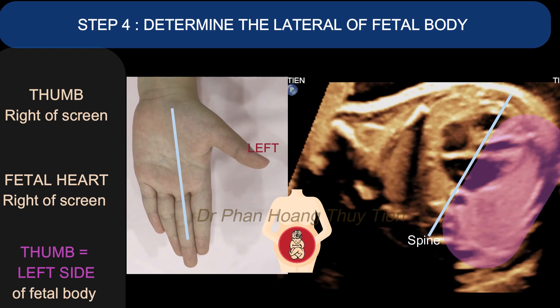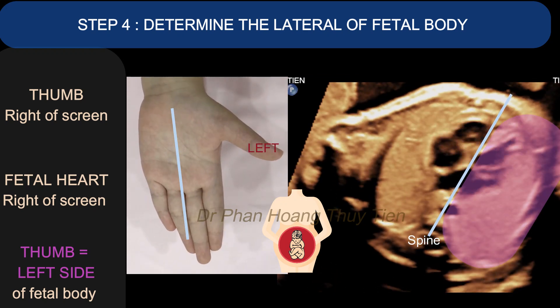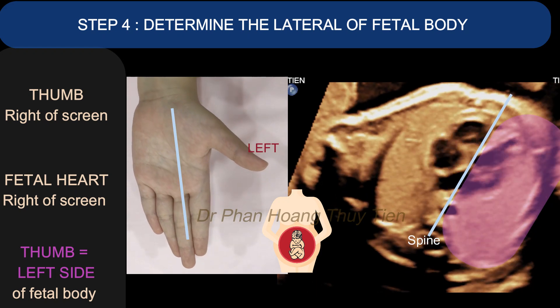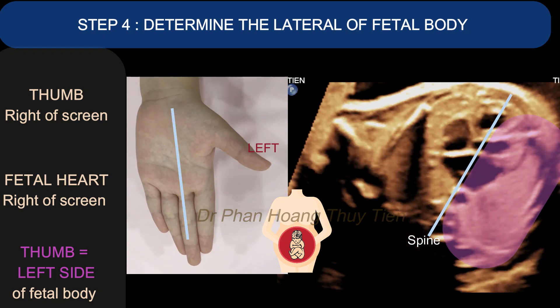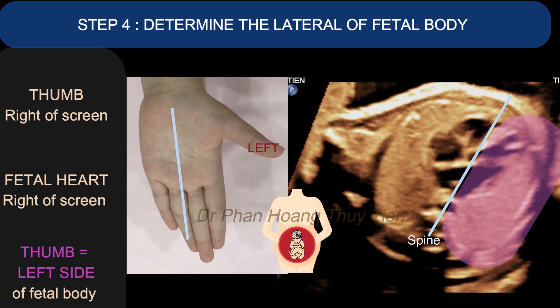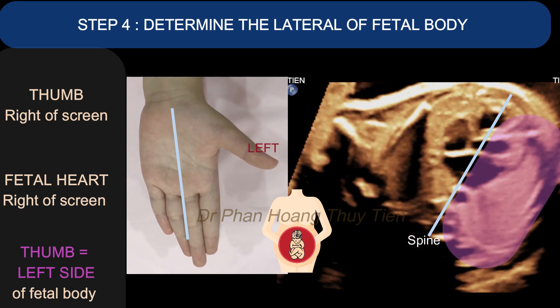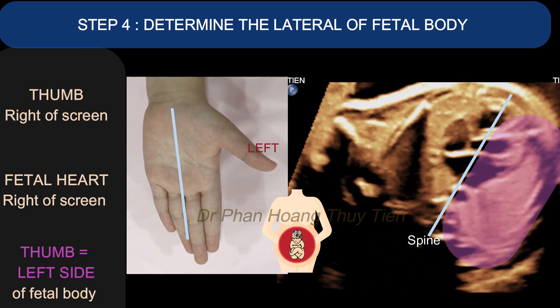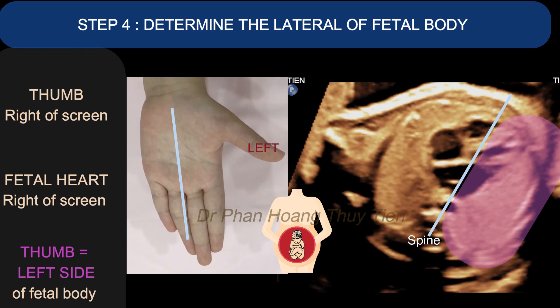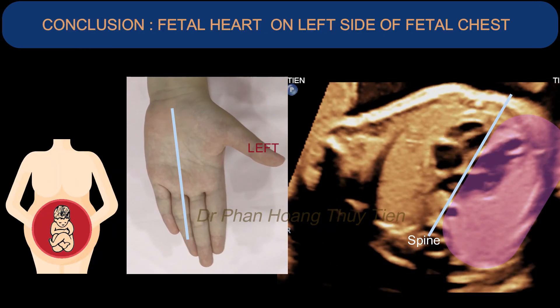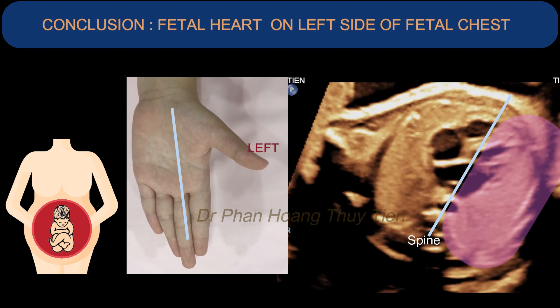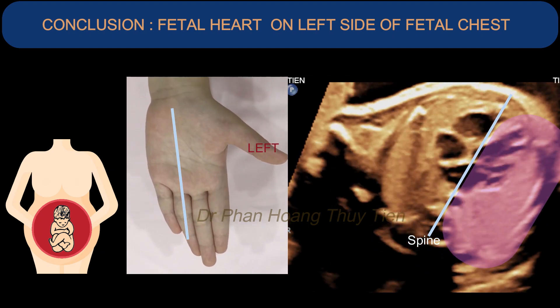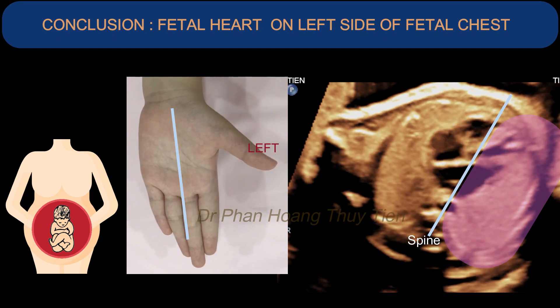You will notice that the thumb is on the right side of the screen. The fetal heart is also on the right side of the screen. Since the thumb always points to the fetal left side, this leads us to the conclusion that the fetal heart is on the left side of the fetal body.